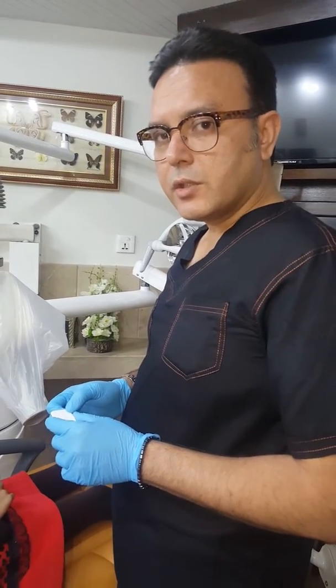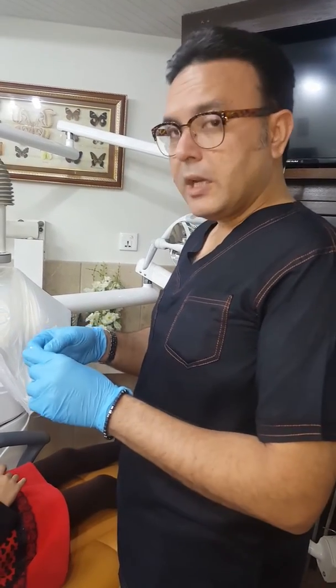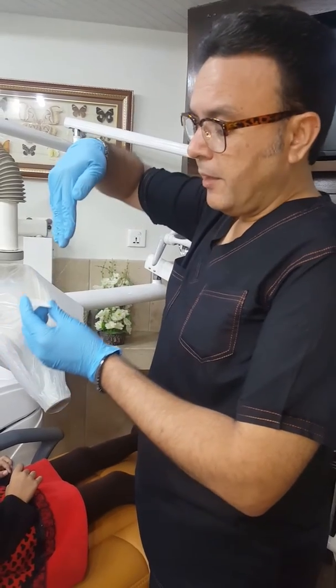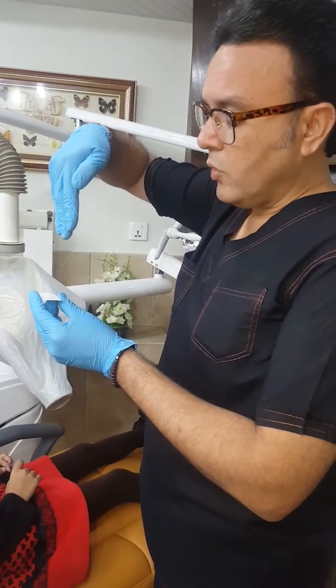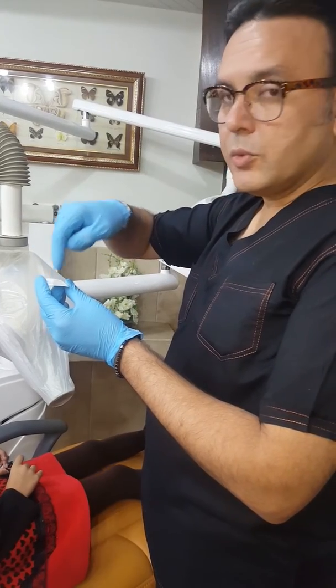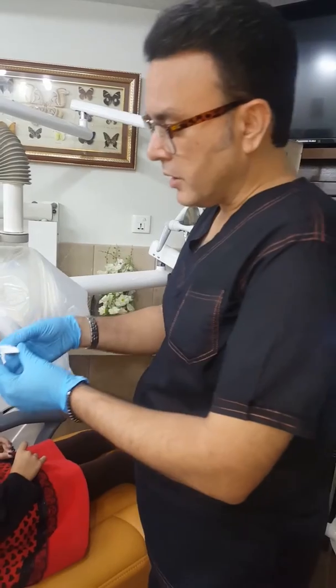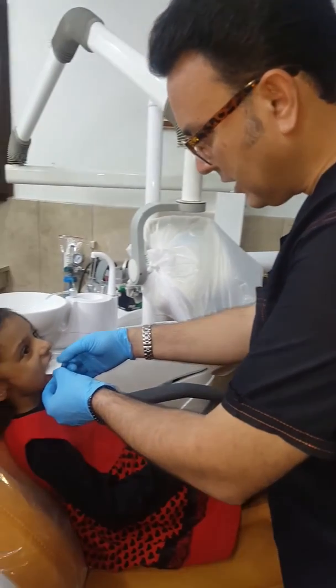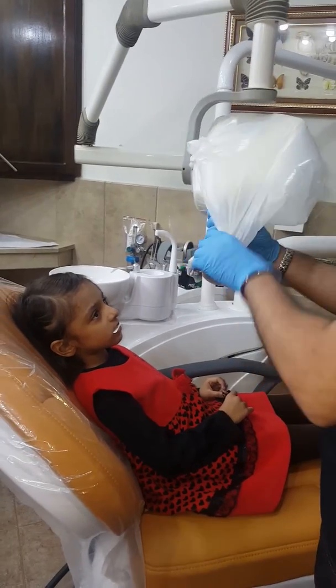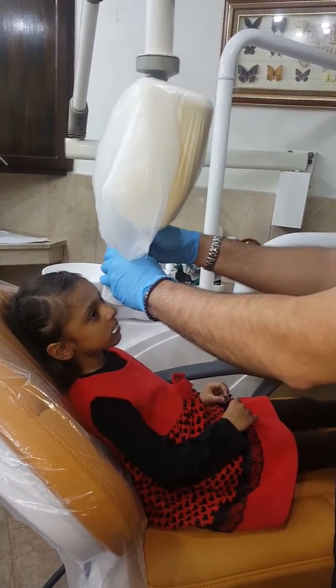We'll take anterior radiographs first of the maxillary anterior region and mandibular lower region. For that, I'm going to use the bisecting angle technique. That means once the film goes inside the mouth, the radiation source—the cone—is not parallel to it but bisects the angle between where the tooth is and where the film is, so it would project the root tips onto the film. This is how it is taken: open, close down. See, the child is very apt at getting this kind of radiography done very quickly. We use a bisecting technique right this way.